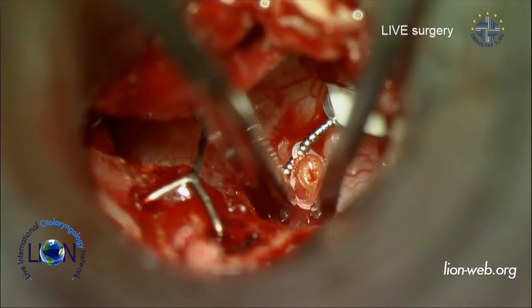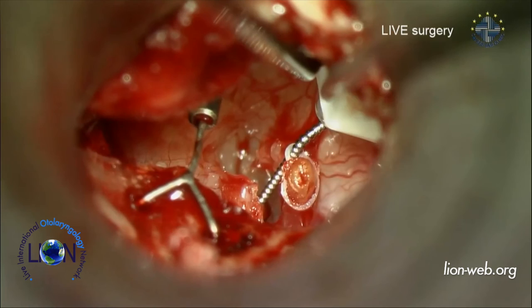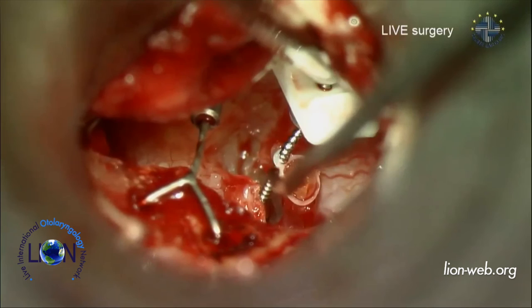This is better now. Wilco is just asking, you're doing this very slowly and gently, yes, but have you ever had a mobilization? I have to do it very gently, otherwise... Oh, yeah, of course, it could happen. If it happens, then we need to stop the procedure and just place the TORP without the silastic band.